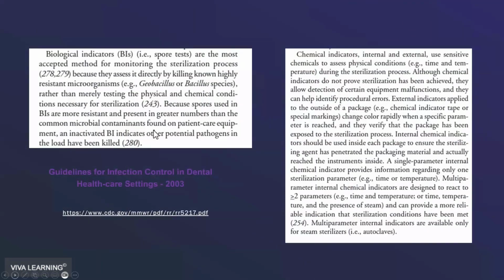Now, there may be some people sitting out there listening to this saying, oh yeah, but does it really say that? And so here are excerpts directly from the CDC guidelines for dentistry that talk about why we use biological indicators, because they're the most accepted method and they directly assess whether we're killing microorganisms. And then talking about the chemical indicators and how they don't prove sterilization.